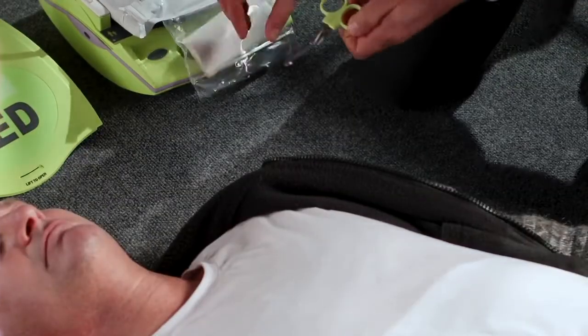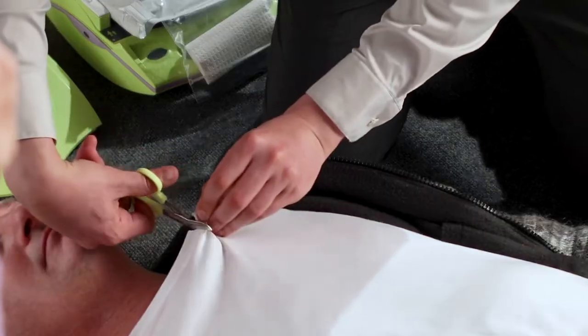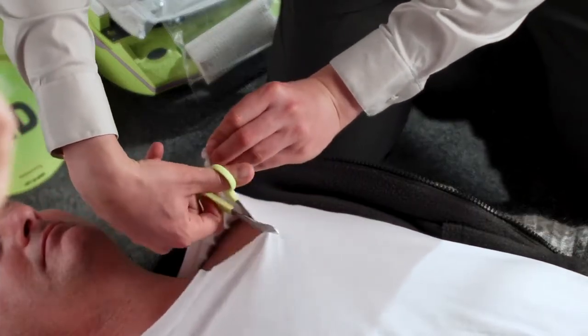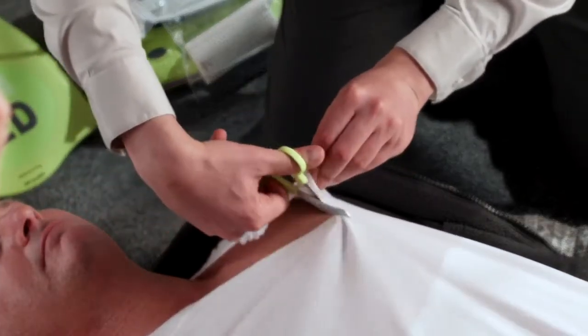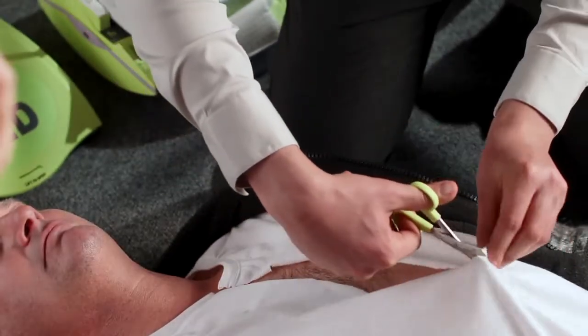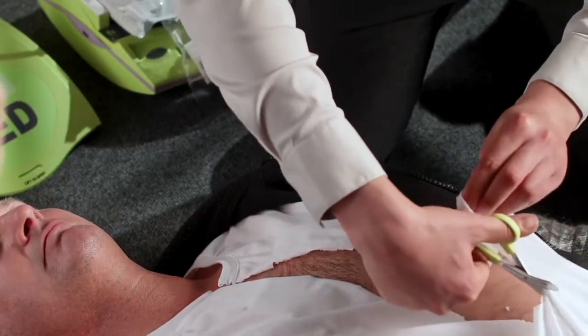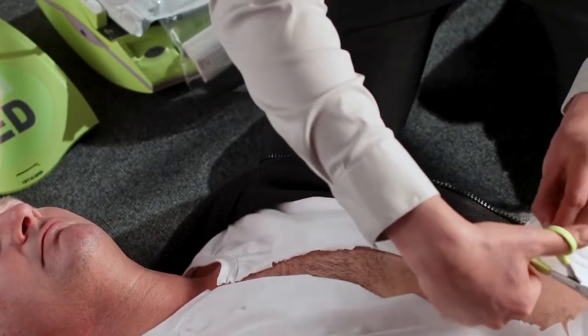All clothing must be removed from the victim's chest. Excessive chest hair and moisture should also be removed if present. The pad package includes scissors, razor, and other items to help prepare the victim for proper application of the pads. Completely expose the victim's bare chest. When using the scissors, always begin at the top of the shirt, cutting downward.